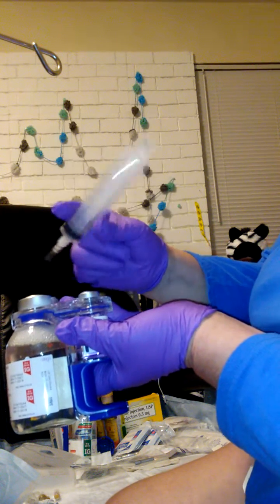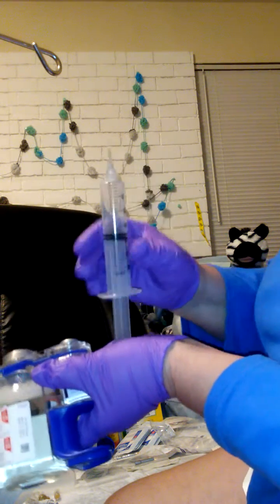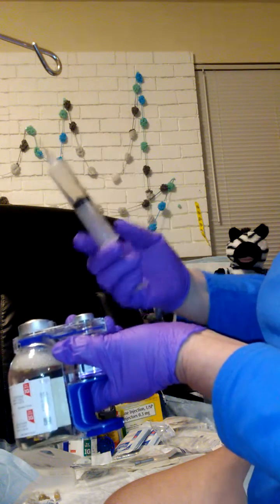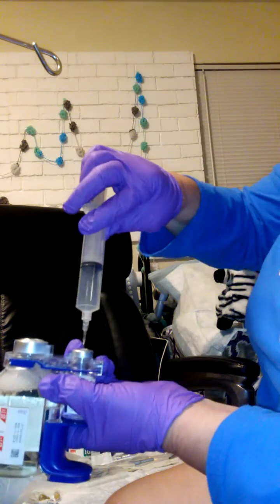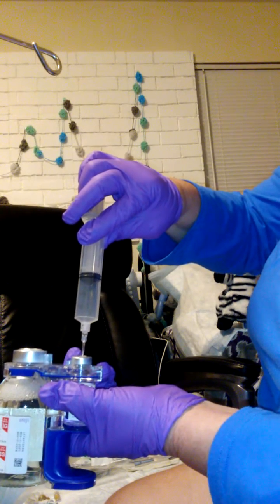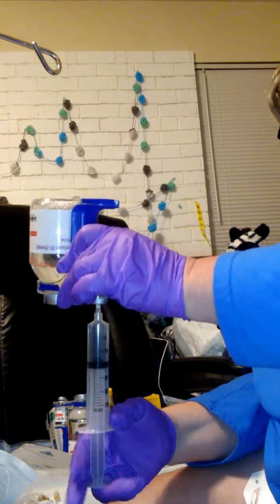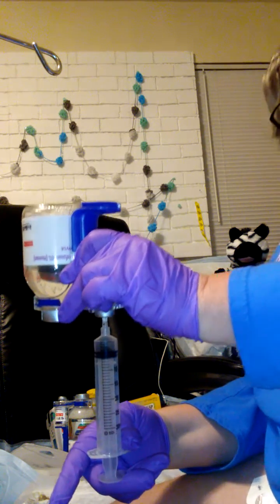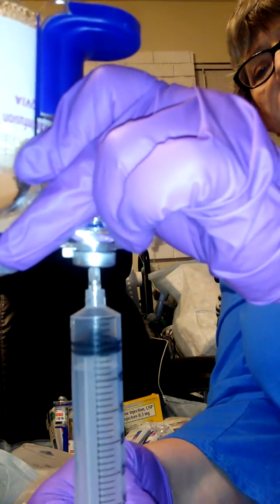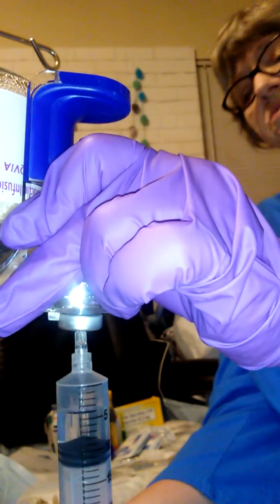I'm going to remove it again because one of the ways to get the medicine to come out is to put some air in here. Get your air in it, and we're going to re-inject. Turn it over, push the air into the bottle, and watch the medicine. The HY is going to start coming out. I hope that's focusing in so you can see it.